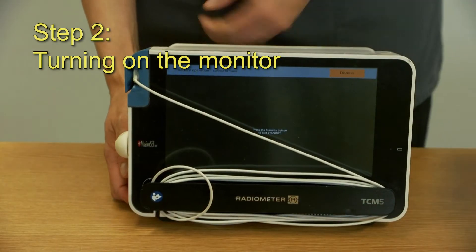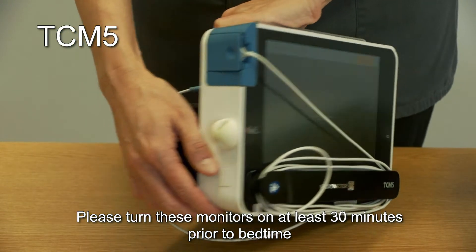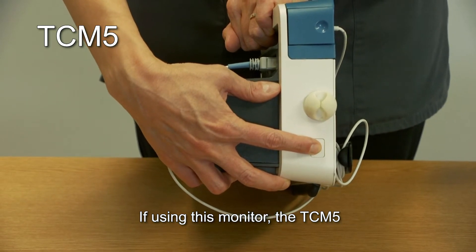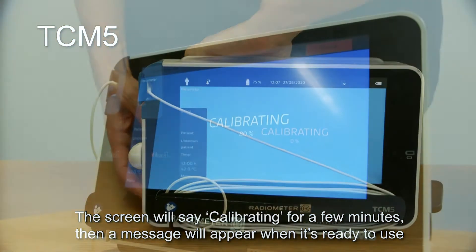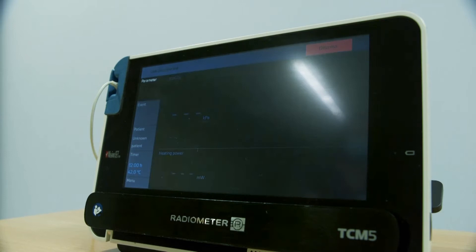Step 2. Turn on the monitor. Please turn these monitors on at least 30 minutes prior to bedtime. If using the TCM5 monitor, press and hold the power button at the side of the monitor. The screen will say 'calibrating' for a few minutes, then a message will appear when it's ready to use.